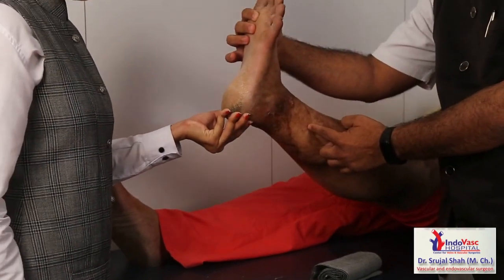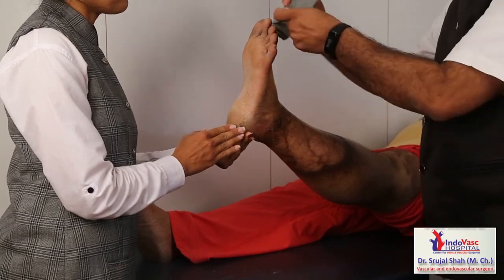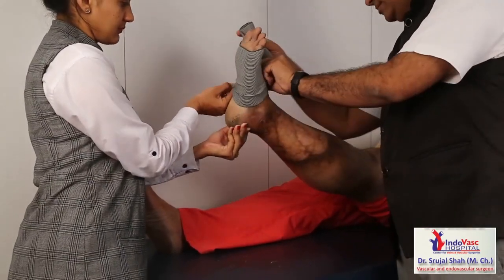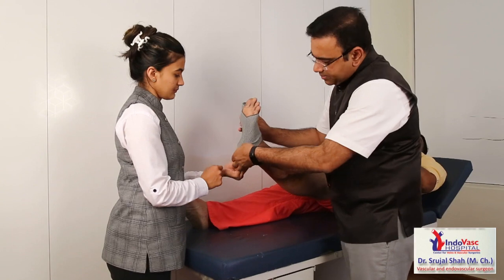It is very important how to apply it. One more thing — the foot and ankle has to be at a 90-degree angle so that proper pressure will be applied to the limb. The pocket goes like this — once you have put it properly, we will start wrapping.